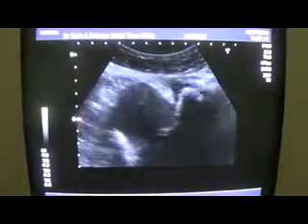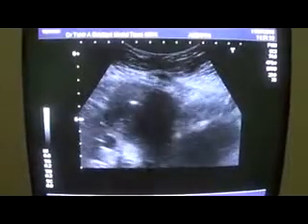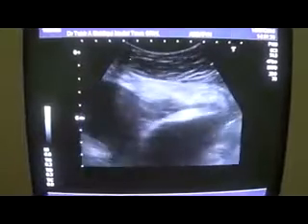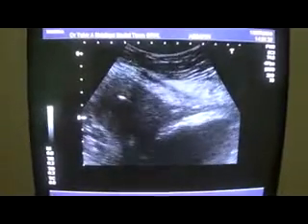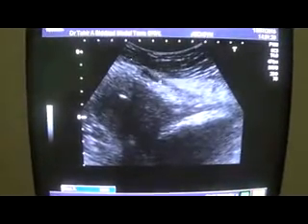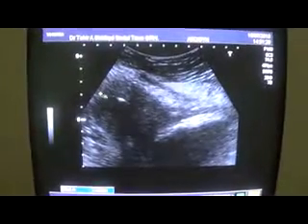I see that, first, just concentrate on the uterus, and you will see that here is the uterus. I am trying to align the uterus with the vagina, and the uterus is being seen at this umbilical region. Now this is the umbilical region where I am seeing the uterus in longitudinal section, incomplete.